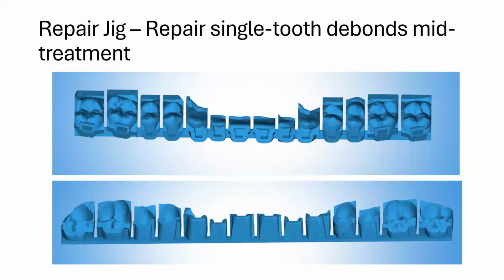You mentioned the ability to go subgingival with DIBS AI. Have you ever had to do a custom base subgingivally? Yes. Especially upper anterior, the trouble tooth is always the upper lateral. A lot of those upper laterals are slightly undersized, but not enough that the patient's going to want to go through any bonding or anything like that, unfortunately. And so you've got to get it as gingival as you can.